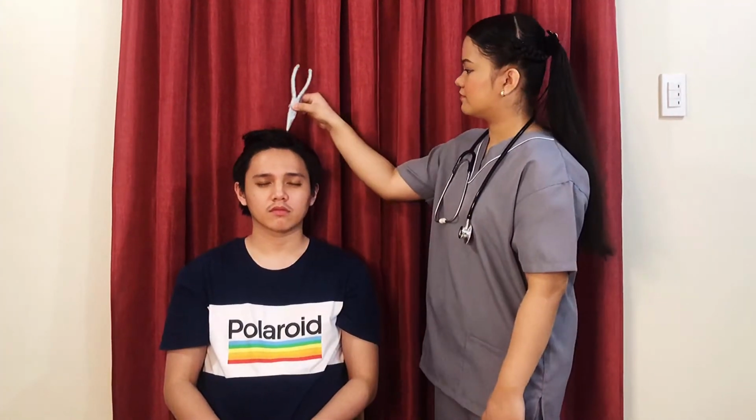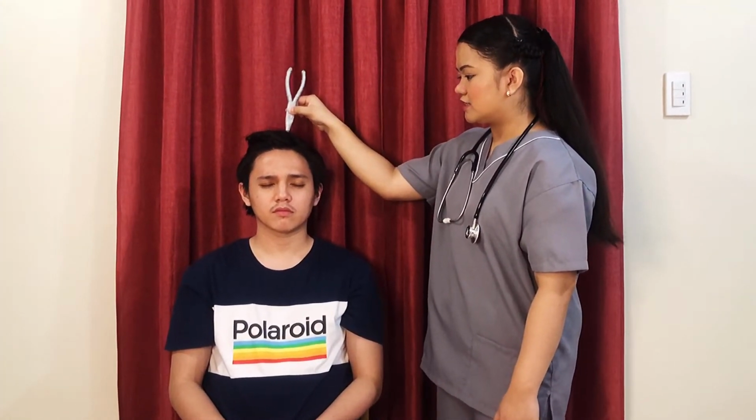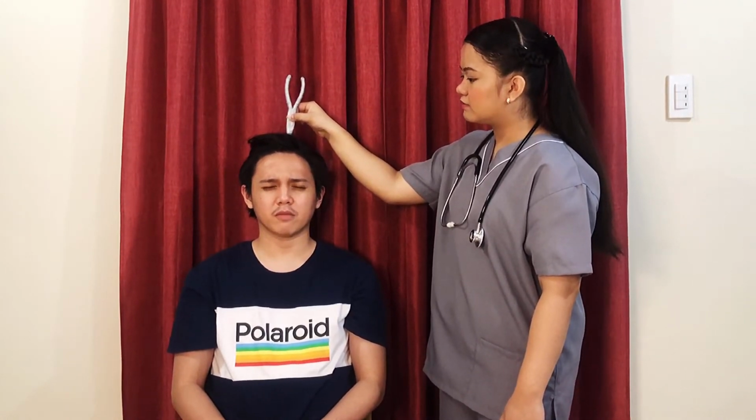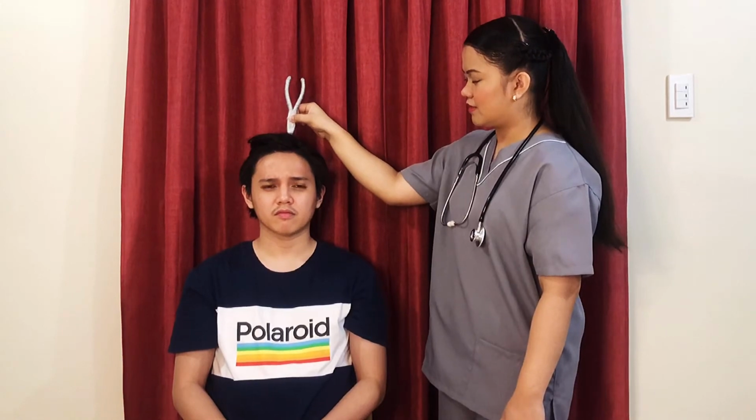So in here, I am going to strike the tuning fork lightly on my hand and then place it on the top of my patient's head. Sir, can you please tell me where you can hear the sound? Equally in both my ears. Okay, sir, that would be great.